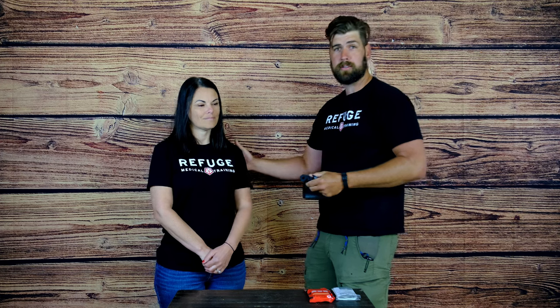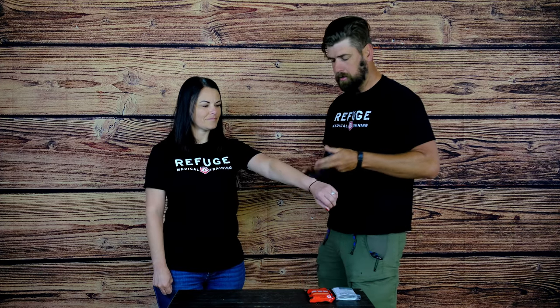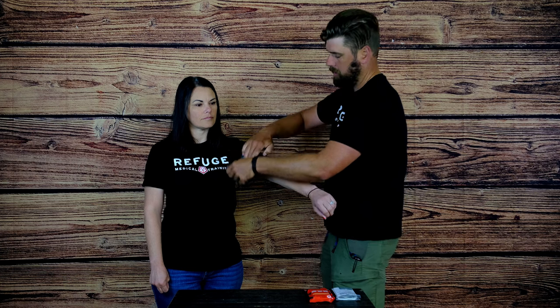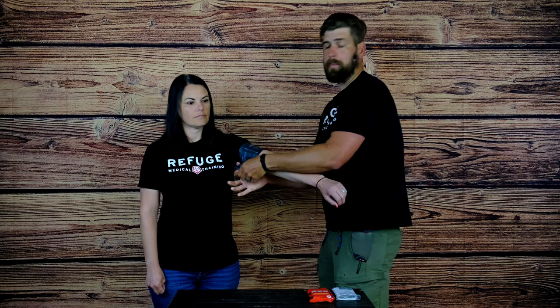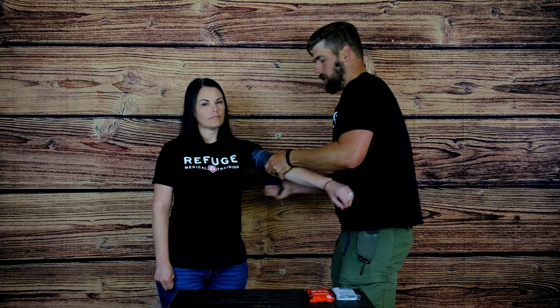Christina is playing our child today. So put your arm out please. If you got a bleed here — arterial bleed — you're going to wrap it, and the first wrap is going to be for friction because this is a friction-based tourniquet. First one around, and then once you're around once, you can start stretching and wrapping.